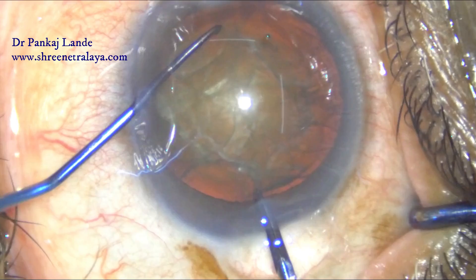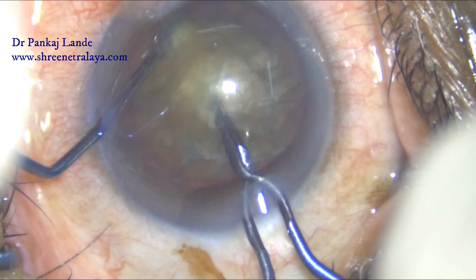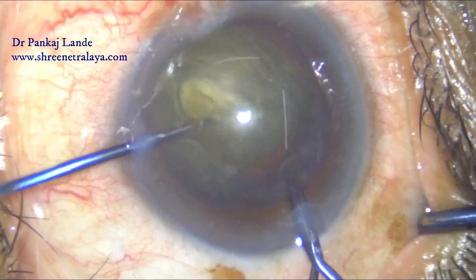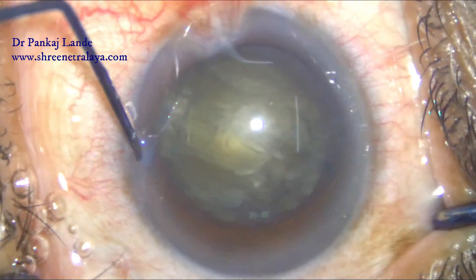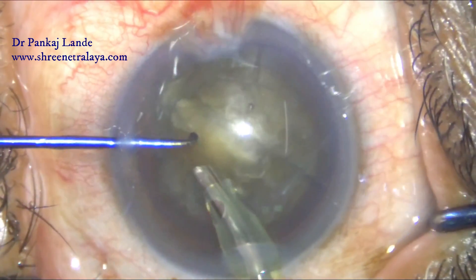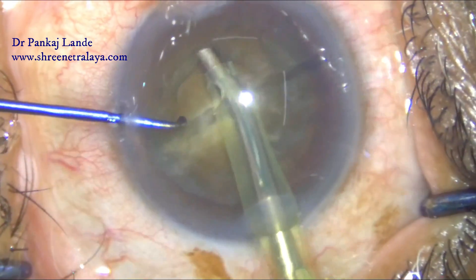I am going below the anterior capsule with my left hand and giving support for the pre-chopper to enter into the nucleus. Once I have entered enough depth into the nucleus to break it, I open the pre-chopper blades and break the nucleus into two pieces. The separation does not look fully complete as the cataract was grade 3 and a bit leathery.